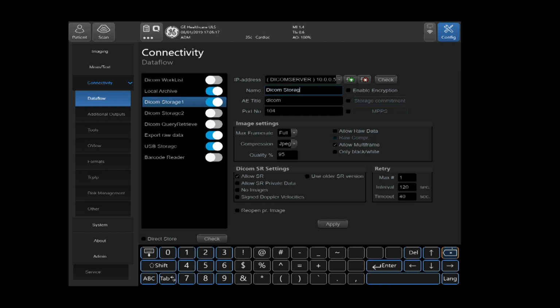We'll go ahead and change the name to PACS. We'll set the AE title of the device. In this case, it's QPath. And this is case sensitive, so it must match the case of the device where you're sending to. Go ahead and select the port field. And we'll, in this case, configure to port 1112.